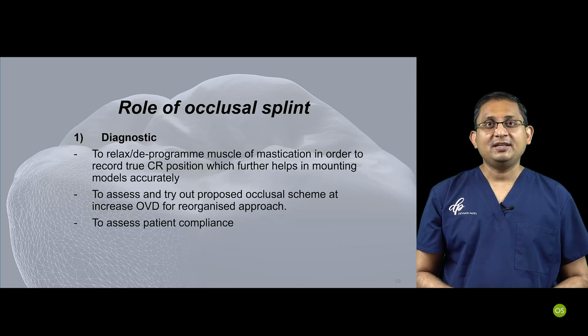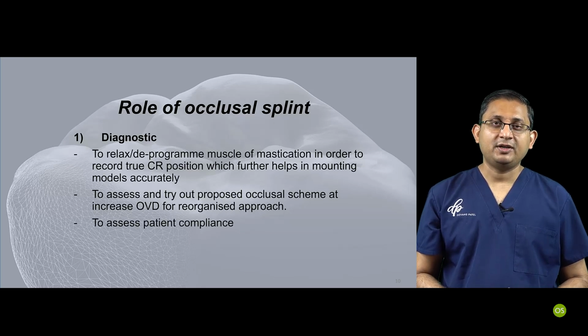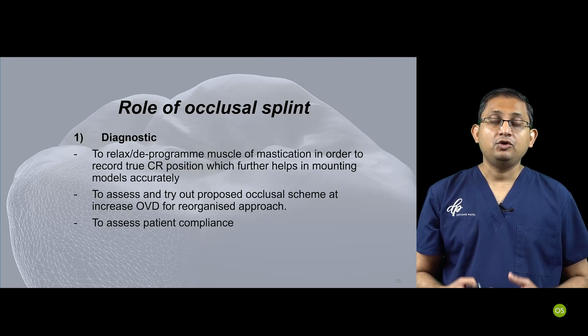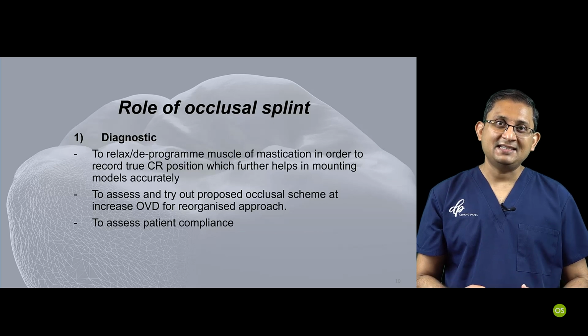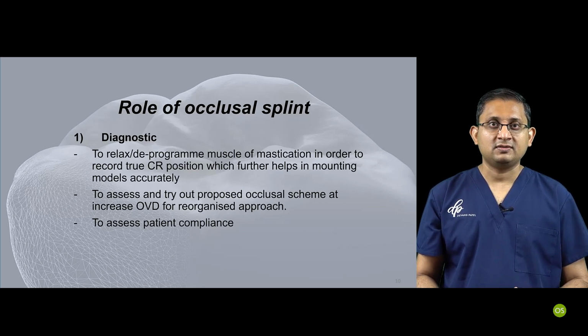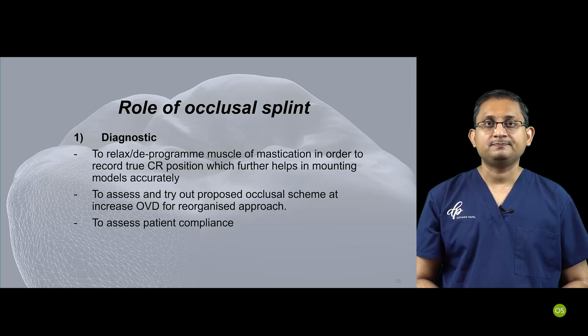It also helps me to assess patient's compliance, because when you're doing full mouth reconstruction or more extensive dentistry, you want patient to wear some sort of a protective appliance afterwards, especially if the reason why your patient needed full mouth reconstruction or extensive dentistry was wear and parafunctional activity, which many times is the case.